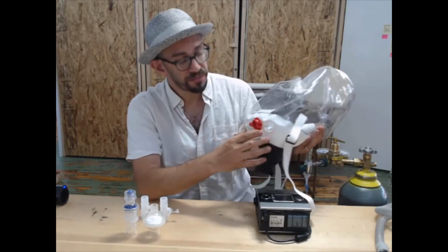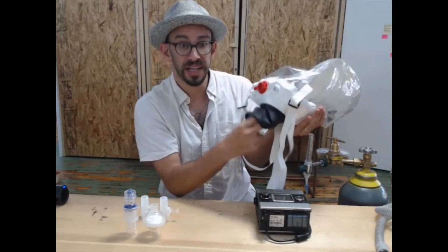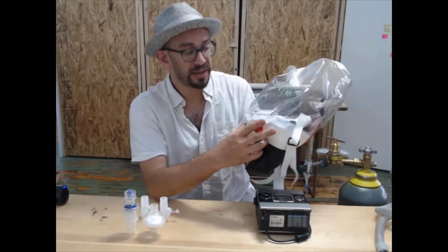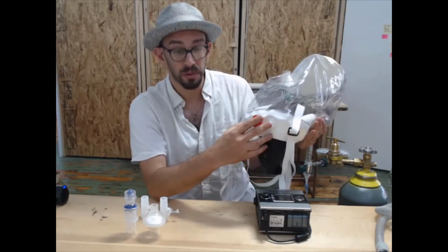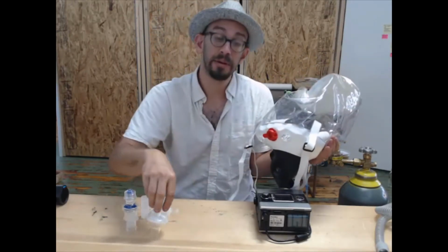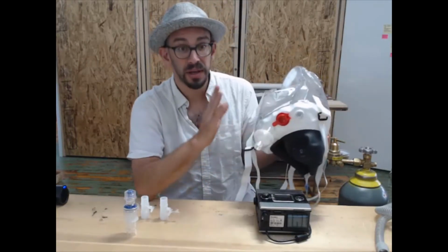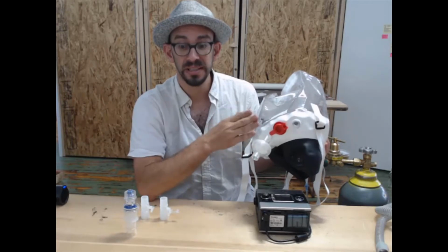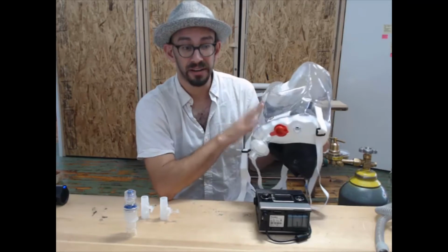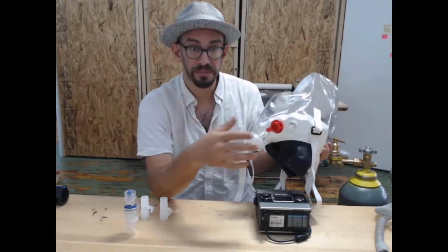What these allow us to do is these hoods have a stretchy neck seal that forms an airtight seal around the patient's neck. The only way that air can go in or out of the circuit is through these two ports. And we bring air and oxygen in, and we put a 22 millimeter viral filter on the expiratory port. And this filter is the barrier between a patient that is breathing out droplets that contain virus, and the healthcare workers in the room.